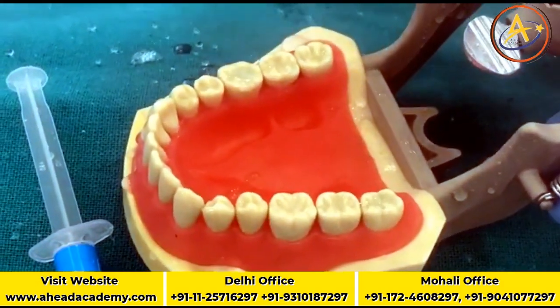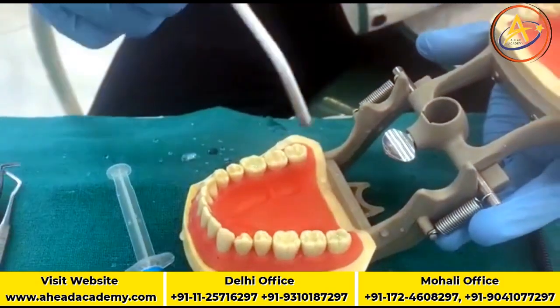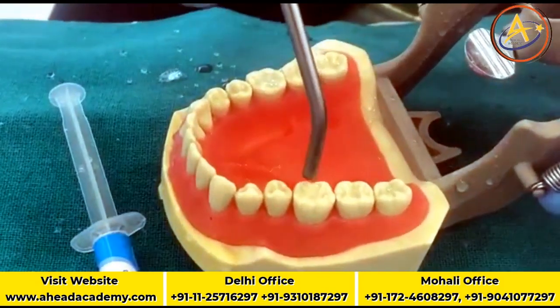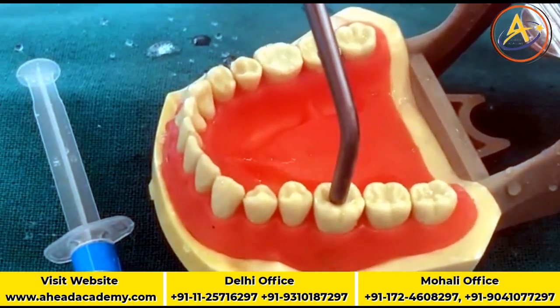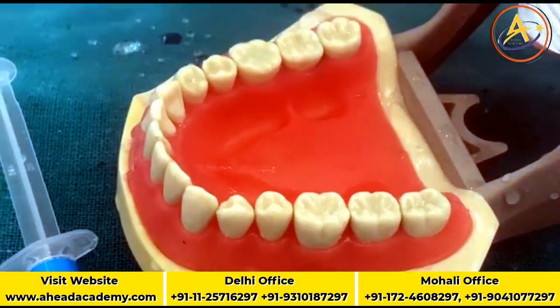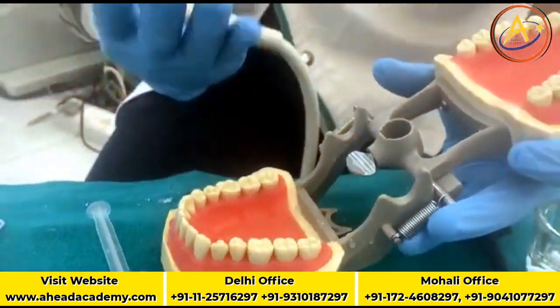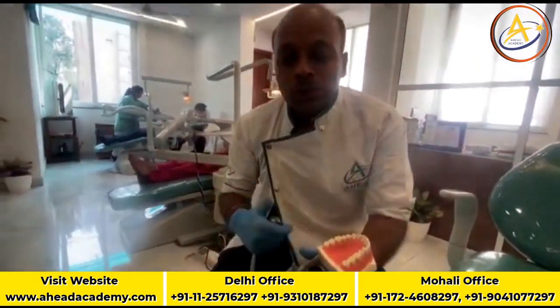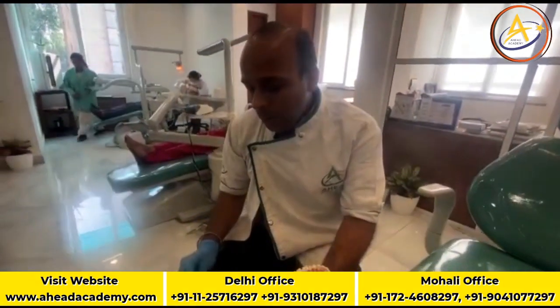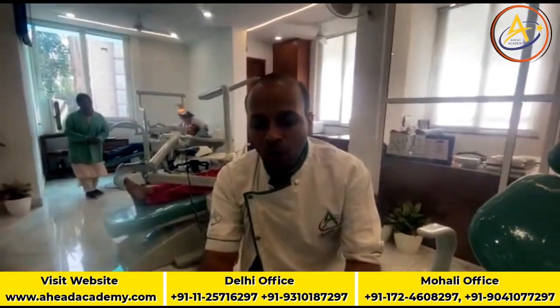Now there is a difference between drying and desiccation. This is what is known as drying. And what is desiccation? This is what we are doing: desiccation. This is what is known as excessive drying. In the dentine, we always go with wet bonding, never with dry bonding. So always dry the surface like this, it's dry. Now it's the time to apply the bonding agent.